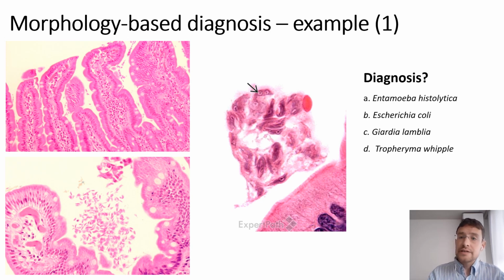My question is, what is your diagnosis? I'll give you some seconds to think about that. And the answer is, of course, Giardia lamblia. So it's something that we can diagnose just on a duodenal biopsy.